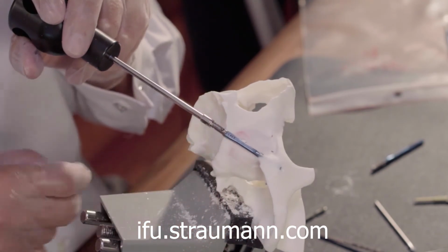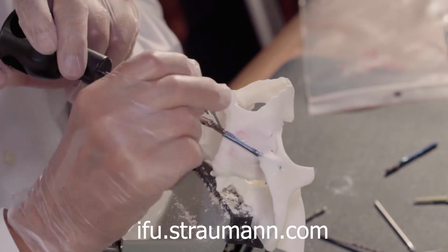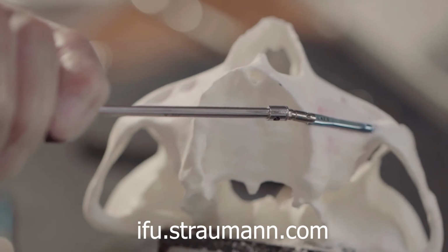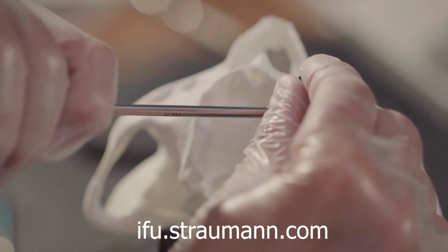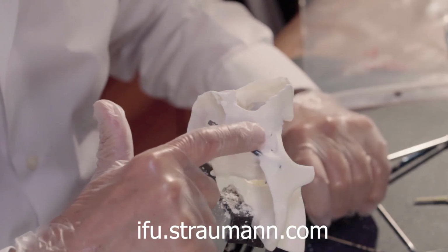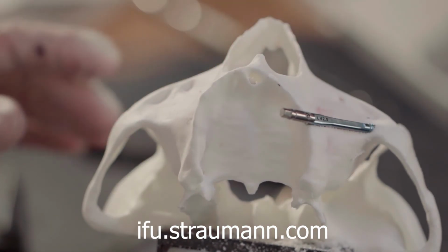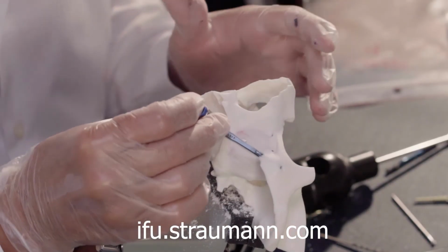Again, we always have to check the screw tightening previous to using the hand instrument. And okay, we use the screwdriver again to check prosthetic direction. So now, very nice, because if we use our finger, we can see the implant profile is not protruding so much against soft tissue. So now, next step, as usual, is going to be to unscrew the implant mount.